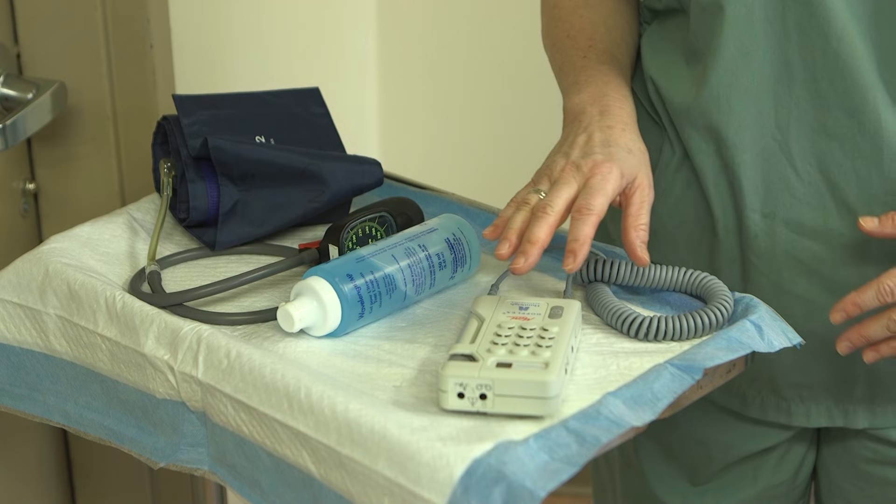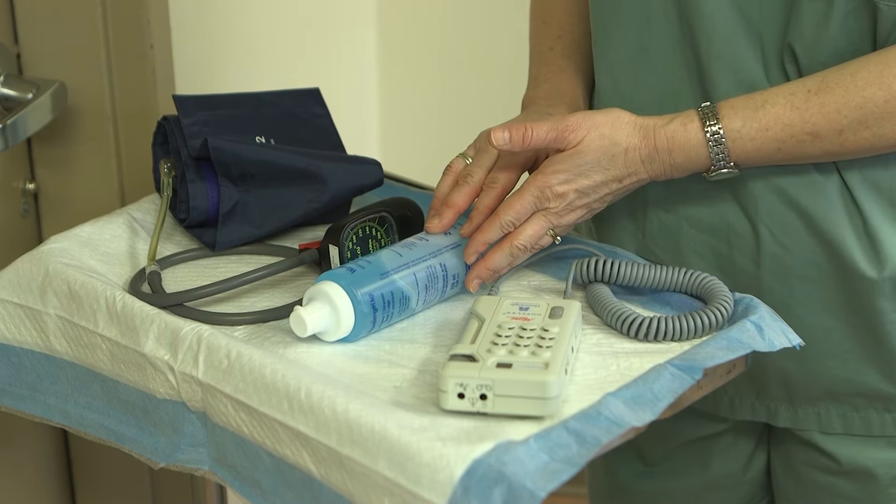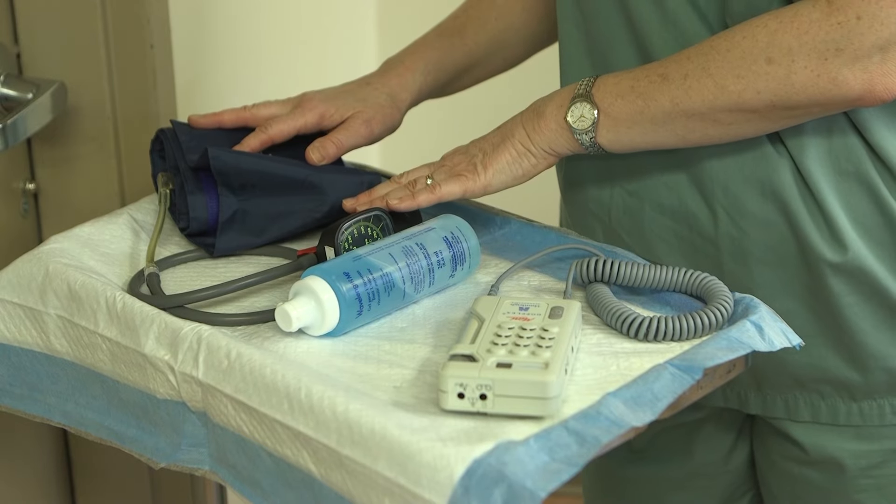To perform an ankle brachial index, you will need a handheld Doppler, ultrasound gel, and a manual blood pressure cuff.